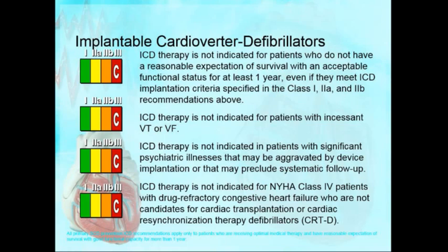If you are on Coumadin, more and more studies have shown that with a simple implantation, there's no higher increase in the incidence of complications. So I've actually done ablations, pacemakers, and ICDs on Coumadin. Not on everybody. If somebody has a mechanical valve, I weigh the benefit, and I do it. Things can go wrong. However, it's considered to be safe.